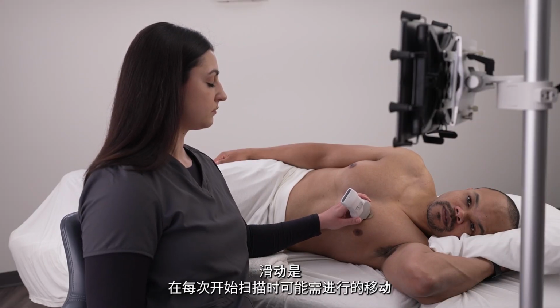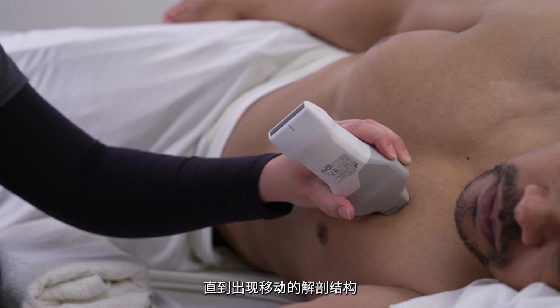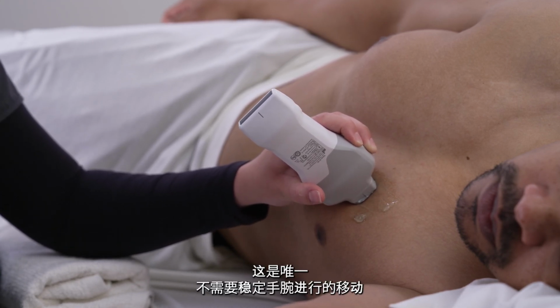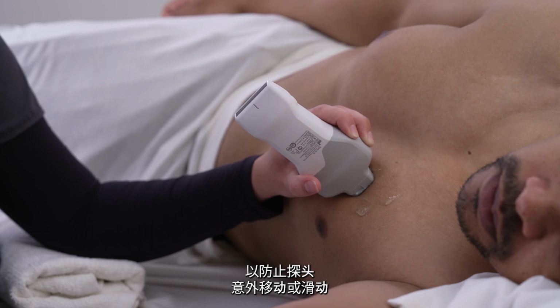Sliding is the movement you will likely perform at the beginning of every scan, making large, slow circular sweeps until moving anatomy appears. It is the only movement performed without your wrist stabilized. For all other movements, you want your wrist secure against the patient to prevent any accidental probe movement or slipping.